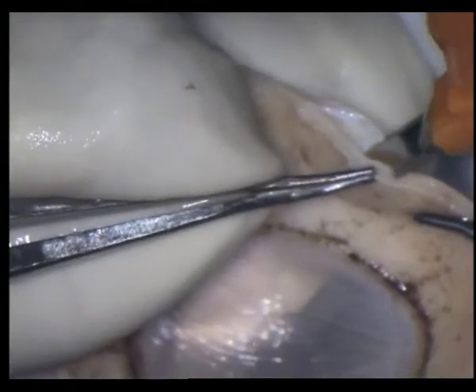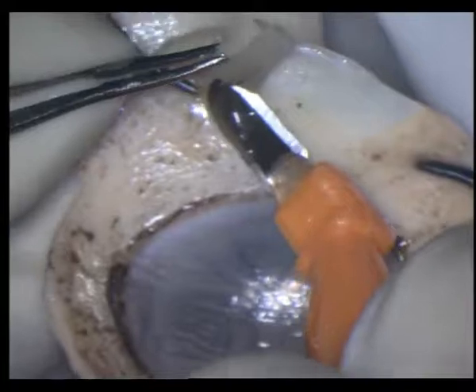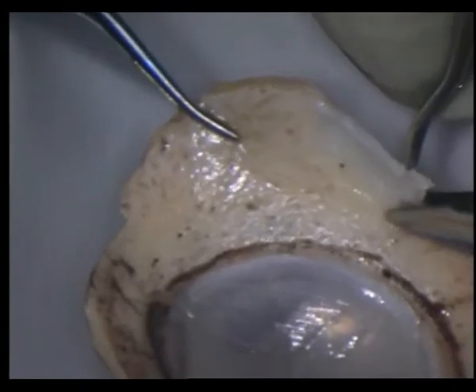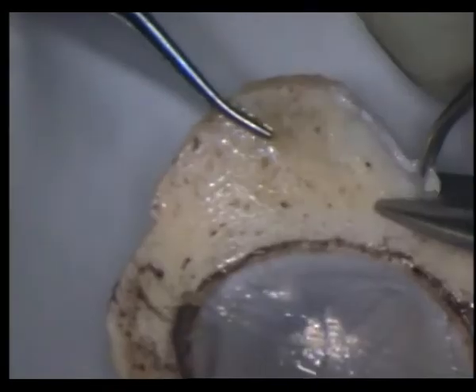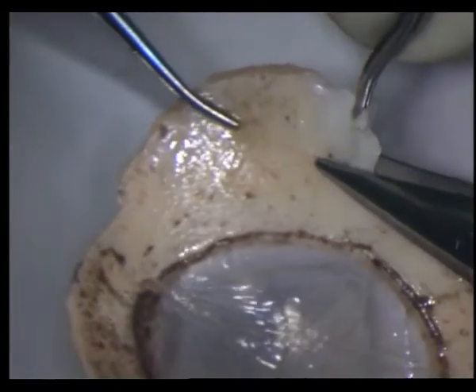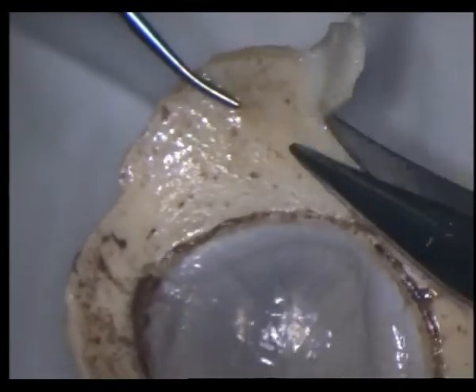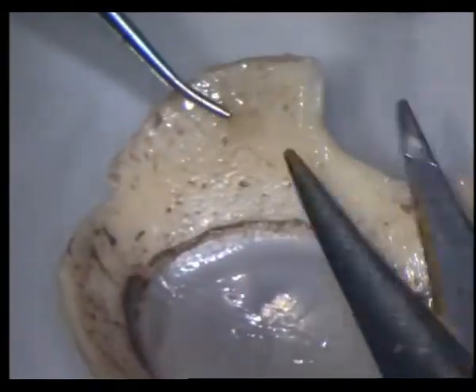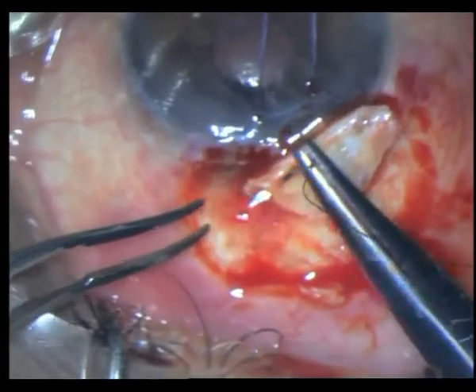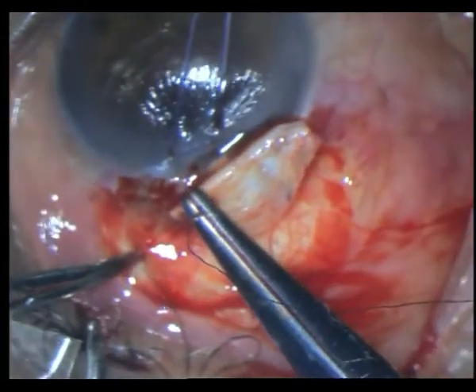You can take either the anterior or the posterior flap — whichever suits you. You do not have to make it aesthetically beautiful; it just has to cover that area. I am taking both the anterior and posterior flaps and whichever I feel is better I will use. It is very difficult — looks like a simple job but very difficult to cut freehand like this. And as you can see from the shape, it does not matter.